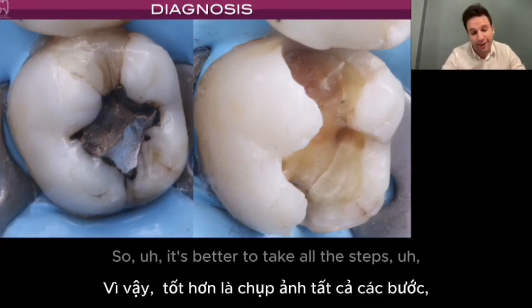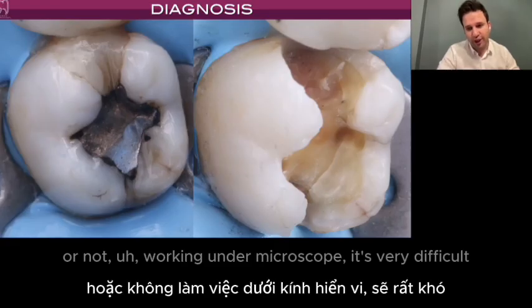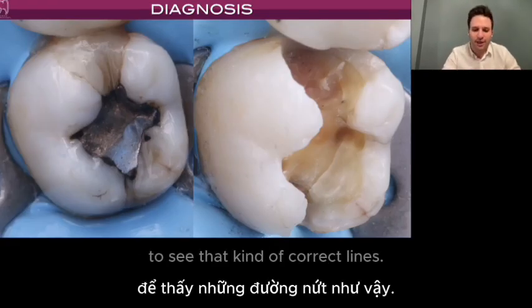So it's better to take photos of all the steps, but if you are not taking photos or not working under a microscope, it's very difficult to see that kind of crack line.